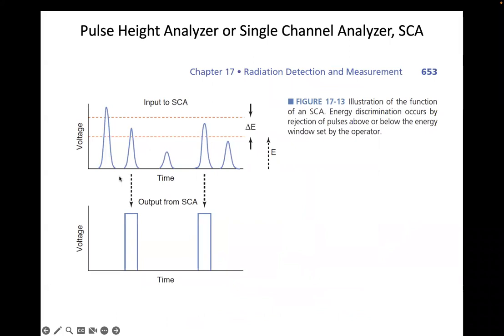And so that pulse height we can actually measure on a computer and say, look, if the pulse height is between here and here, that corresponds to energy, essentially, how many photons were created initially in your crystal.